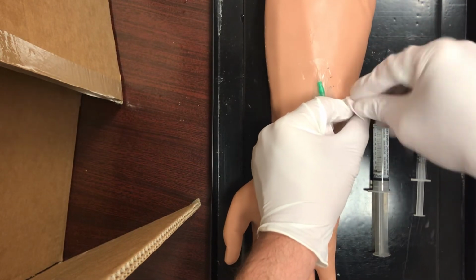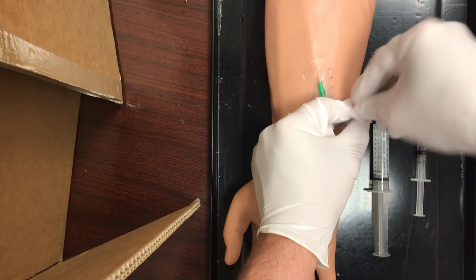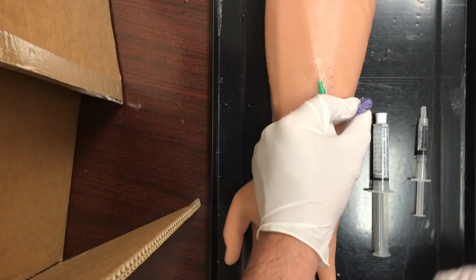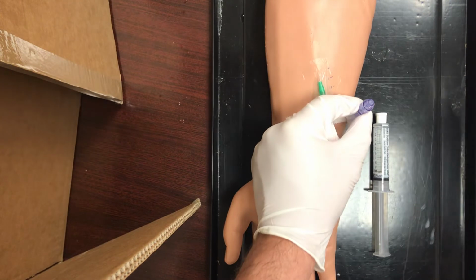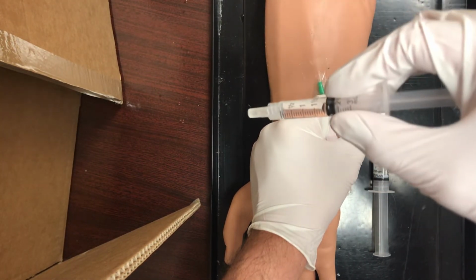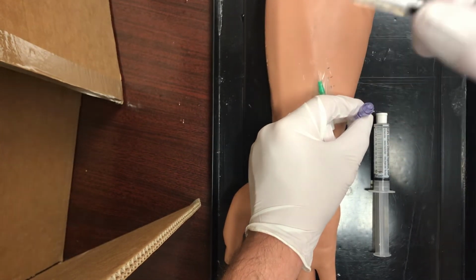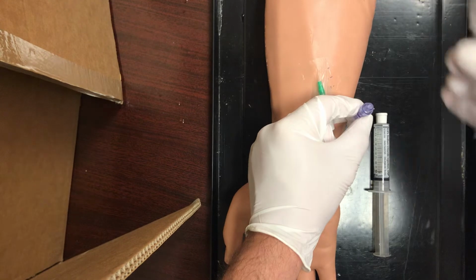So typically with medication, in the syringe there, we do have 2 mLs in the 3 ml syringe. We want to keep a cap on this and make sure it's clean. This syringe should also be labeled with whatever medication is in it. You can also put your initials on and the date and time.